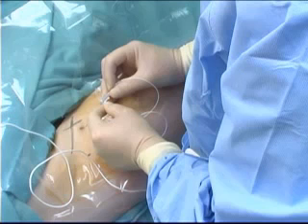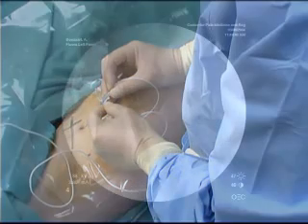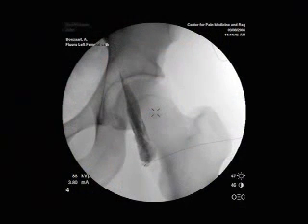If the catheter is placed without quadriceps stimulation during catheter advancement, it simply means that the catheter is not on or near the nerve, and the block cannot be expected to be successful. If required, the catheter can be advanced until adduction of the thigh due to obturator nerve stimulation is observed, but this maneuver is usually not necessary since the spread of local anesthetic agent will be cephalad along the femoral nerve if the catheter is properly placed.